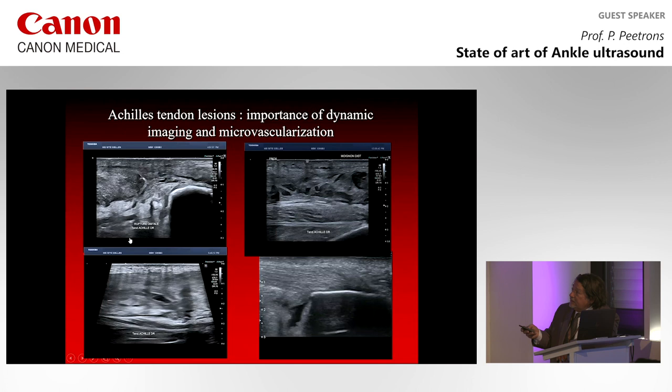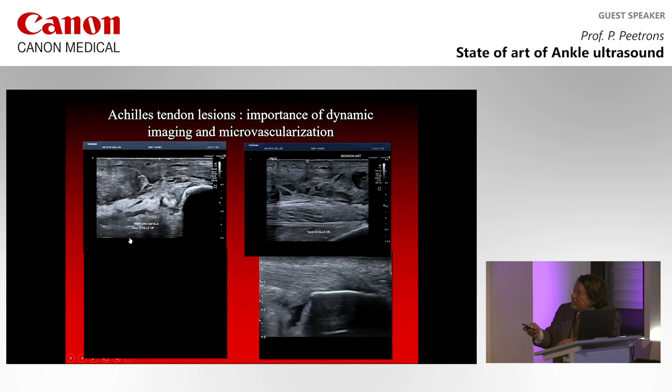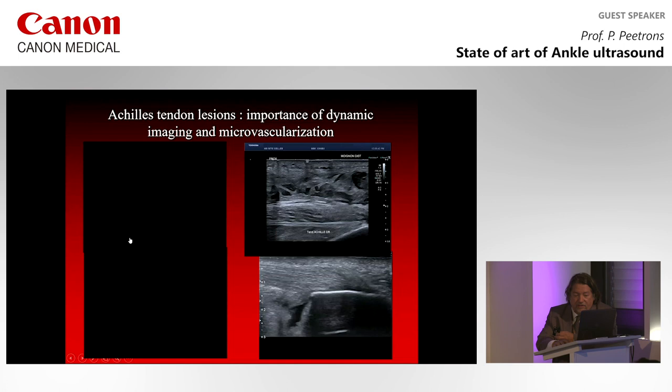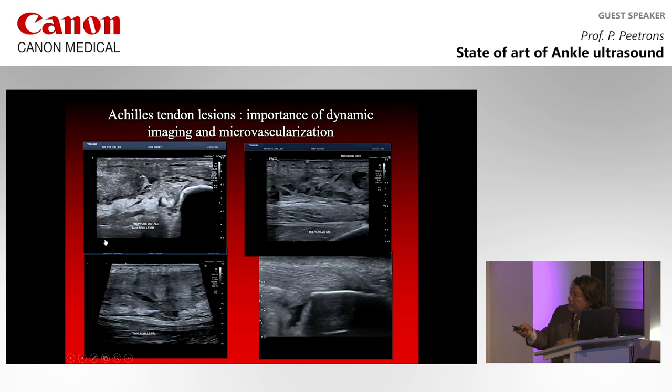I moved the foot, and you see that this is not moving at all, or in fact, it is moving on the other side. You can see that when the ankle is going there, the tendon is going that way. So there is no tendon at all on the calcaneus. This is very important to tell the surgeon because he has to fix the tendon to the calcaneus. He doesn't have to repair the tendon. He has to fix the tendon to the calcaneus. There is no tendon on the calcaneus.